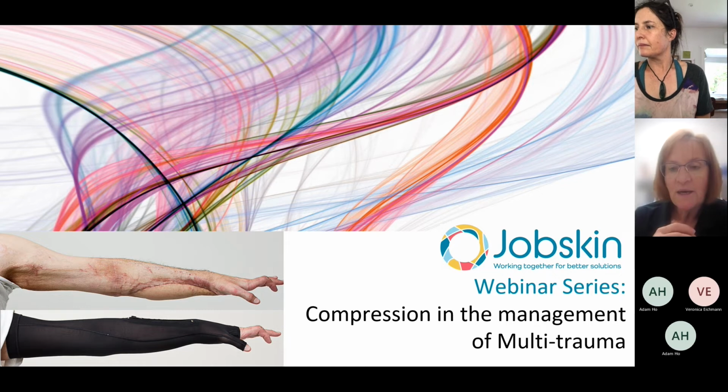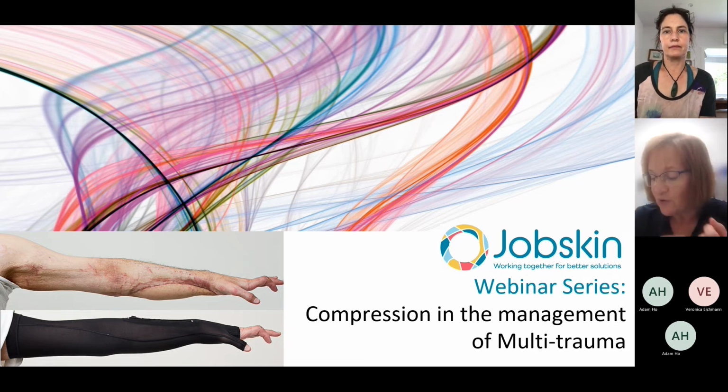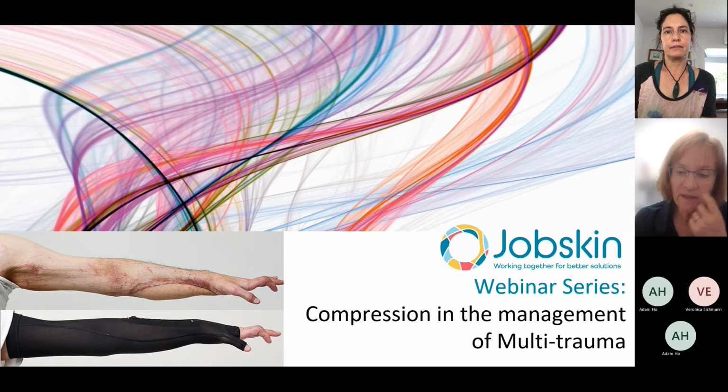And so that impacts the shape of the garment, the composition of the garment, but also how we anchor it, how it can be put on or taken off, and how well it conforms. So there's a whole lot of factors that come into play.